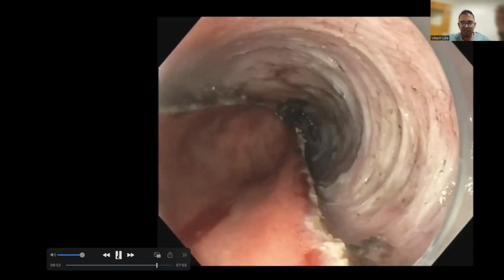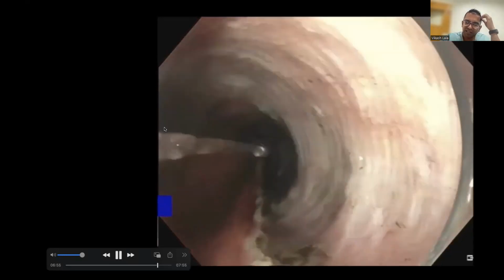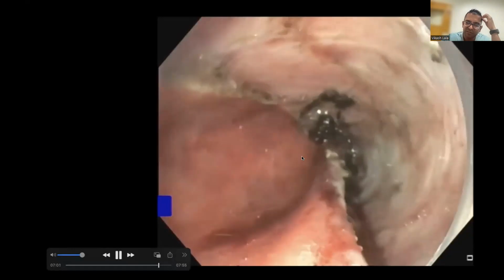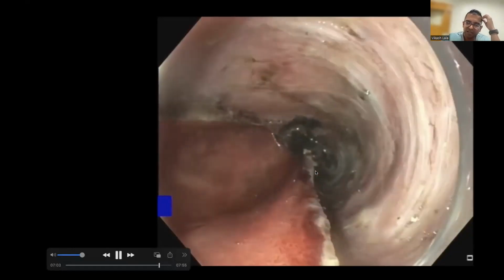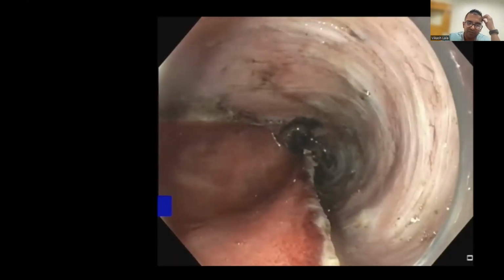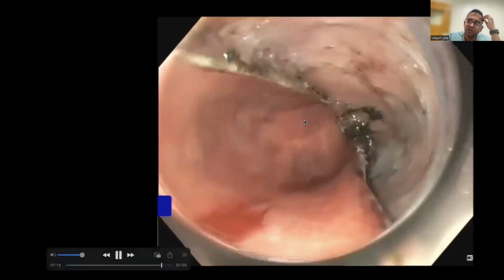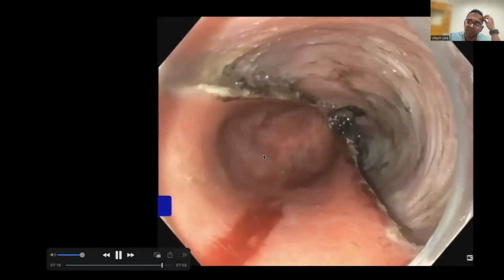And that was the end result. So that's after the resection. And you can see that I probably did about 65% resection of the circumference. And I went quite big. So it's a very large area from the GOJ, quite high up. And I ended up taking out quite a big segment of this patient's esophagus. And I didn't feel that a CAP EMR was going to cut it. I thought ESD was the only way to get everything out en bloc. So I went with an ESD, not a CAP EMR.